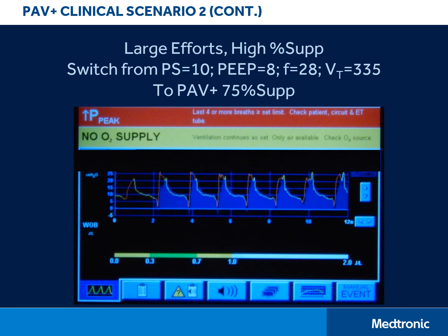You can see that as soon as PAV is started, the high pressure limit started sounding, and shortly after, the PAV Plus startup too long alarm sounded as well. The patient is clearly not tolerating this transition. So what is the issue here?